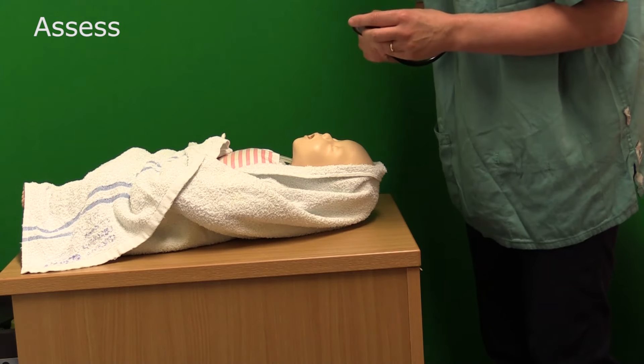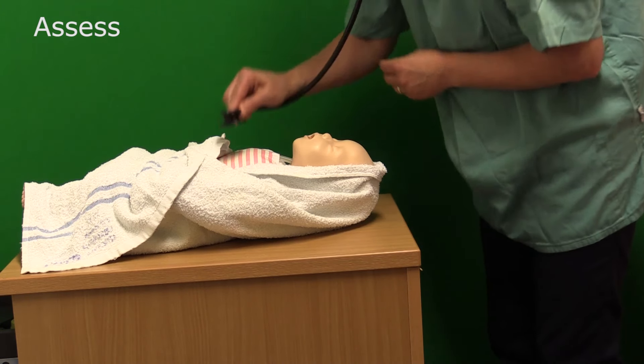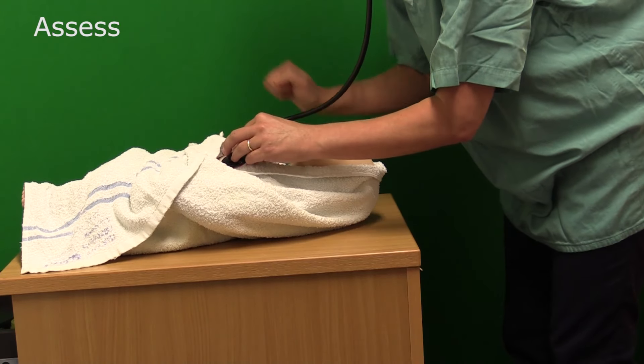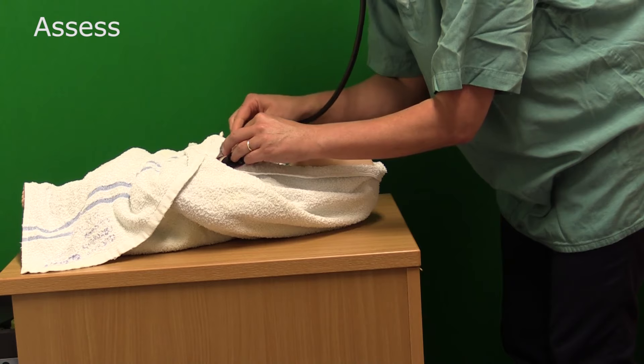Best practice is that you measure the baby's heart rate using a stethoscope — a neonatal one would always be useful. When you check the baby's heart rate, you must always tap it out. This indicates to other professionals that are with you the condition of the baby.